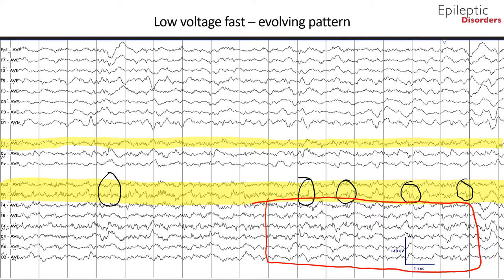Throughout the course of this page, the low-voltage fast activity and embedded sharp waves in the right frontal chains evolve to polymorphic sharply contoured activity that becomes rhythmic, especially in the F8, F4, T4, and T6 regions outlined by the red square. Also noted is regional hemispheric involvement of the C4 and P4 regions with polymorphic quasi-rhythmic delta activity that appears sharply contoured with embedded spikes outlined by the green arrows.